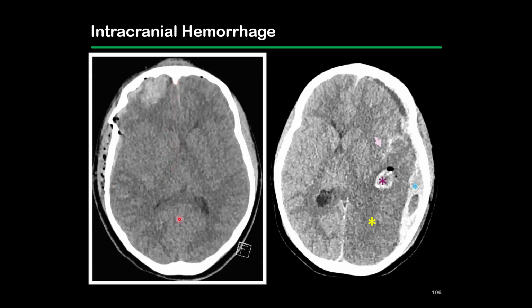So here's your midline, and your ventricular system is shifted a little bit over toward the left. So there is some mass effect from this hemorrhage. This is a different kid who had a trauma. And we can see that there's, again, a subdural hemorrhage that's mixed density. So some areas are brighter, some areas are darker.